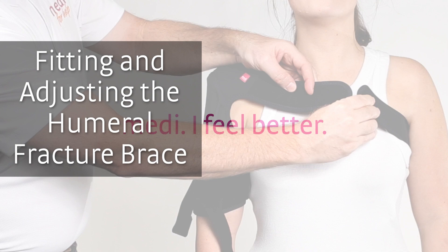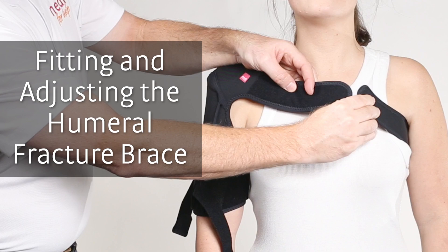Welcome to the video fitting instructions for the Medihumeral Fracture Brace. In this video, we will show the correct process for fitting and adjusting the Humeral Fracture Brace.